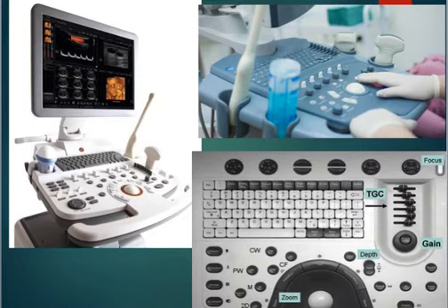These are some of the different ultrasound machines' control panels. So knowing how to use these different buttons is referred to as Knobology. There's a lot of different buttons on here and it can be overwhelming at first. I mean, the keyboard itself is simply just to be able to type information. Some of the more important things you've got here on each of the machines, what we call a trackball. So the trackball kind of just acts as your mouse to scroll around the screen and move things.